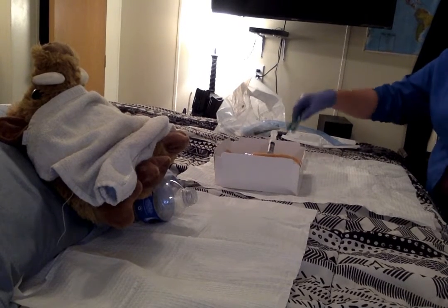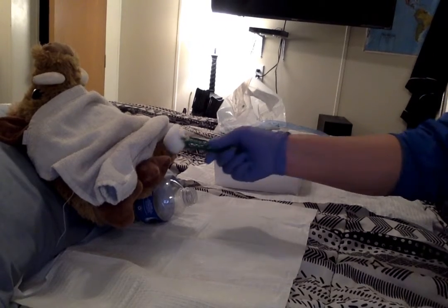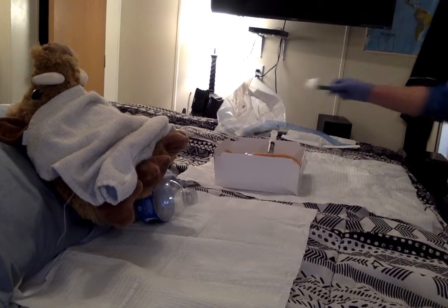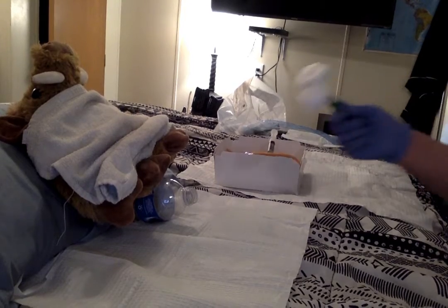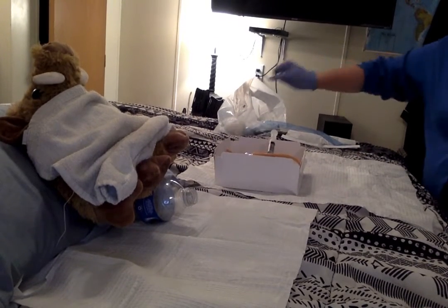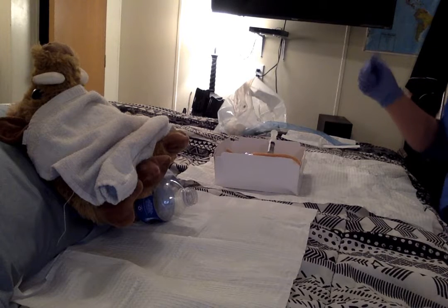Then we're going to grab another cotton ball, and we are going to go from front to back, down the meatus, making sure everything's clean, and we're going to throw that in the trash. And then one more time, we're going to grab the rest of our cotton balls, whatever's left, and we're going to do the same thing again. Clean the middle. And we're going to throw all that in the trash, including the little clippy thing, the forceps.